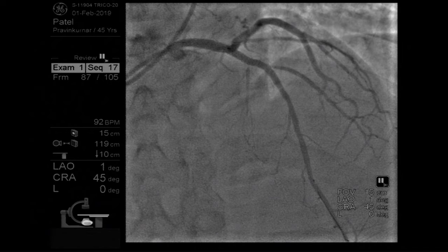So proximal. What balloon do you want me to take? Okay, I try to measure the ring. Here to here might be 4.3, right? So a 4.5 balloon? Yeah, 4.5 balloon. Non-compliant balloon.